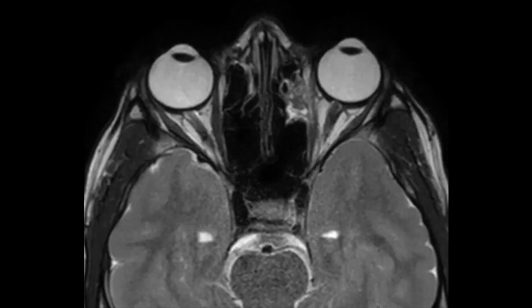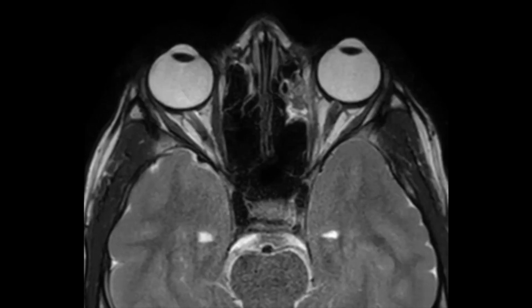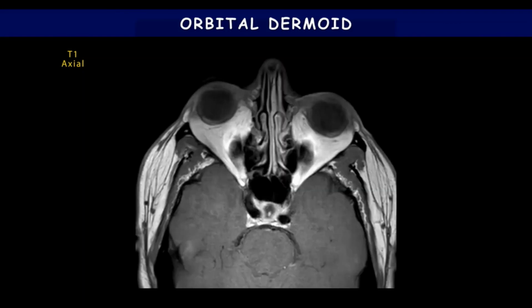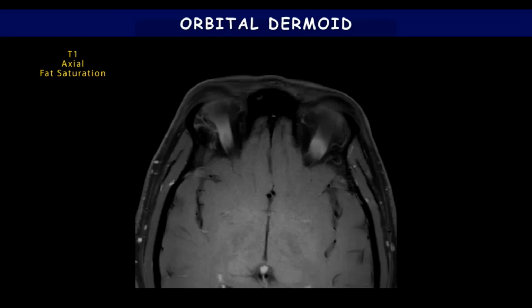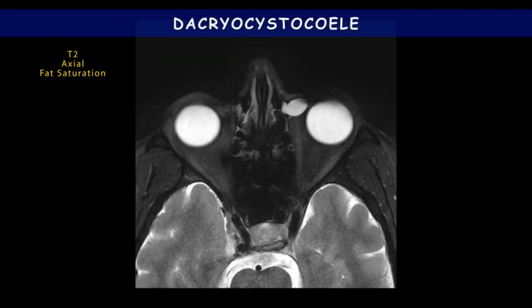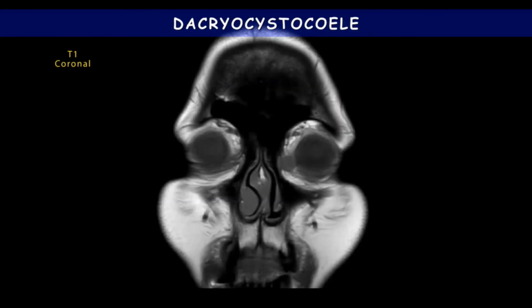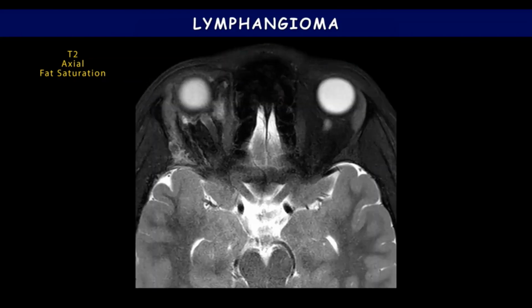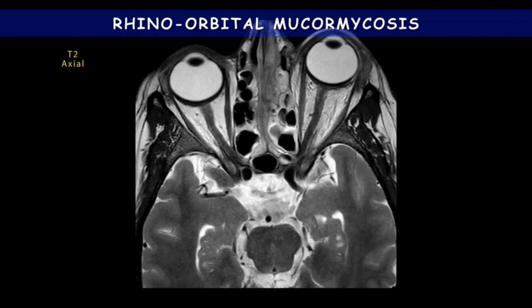MRI is also used for degenerations and depositions like progressive myopathy, amyloid deposition, and scleroderma. Dynamic MRI imaging can be used for acquiring timed series of images to demonstrate abnormalities of ocular motility and differential enhancement in mass lesions. Recent developments in technology, including orbital surface coils, fat suppression techniques, fast gradient echo pulse sequences, and MR contrast agents, have provided spatial and contrast resolution with direct multiplanar imaging, enabling us to study the lesions and surrounding structures extensively.